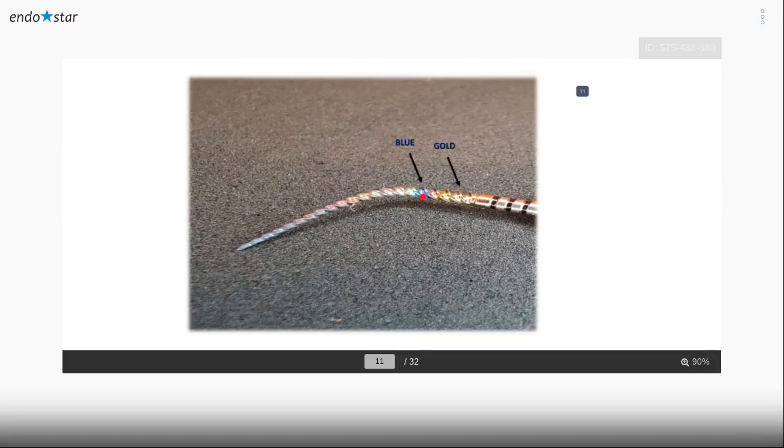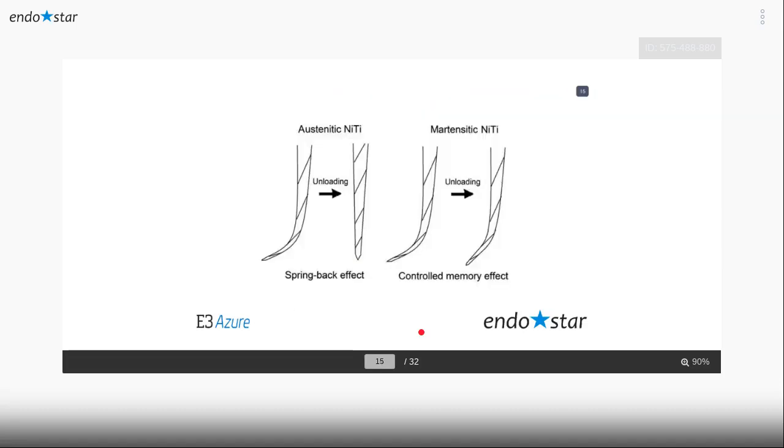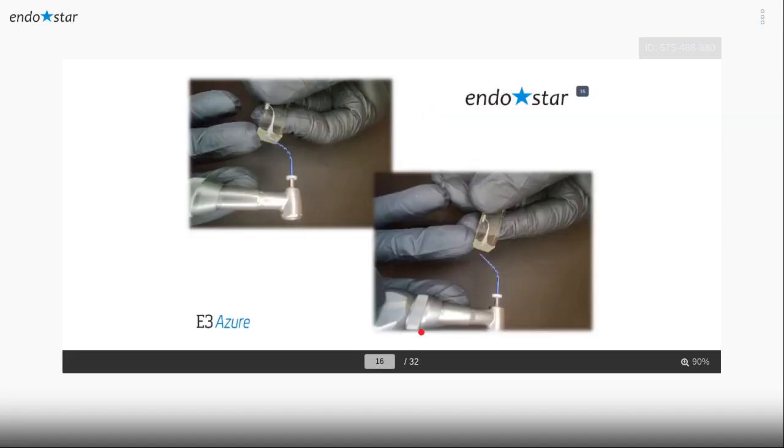Only a change in temperature or cooling process during production can give a tremendous change in the mechanical properties, not only regarding the design and the taper. Changing temperature by a small difference gives new generations of files, which are available in the market.